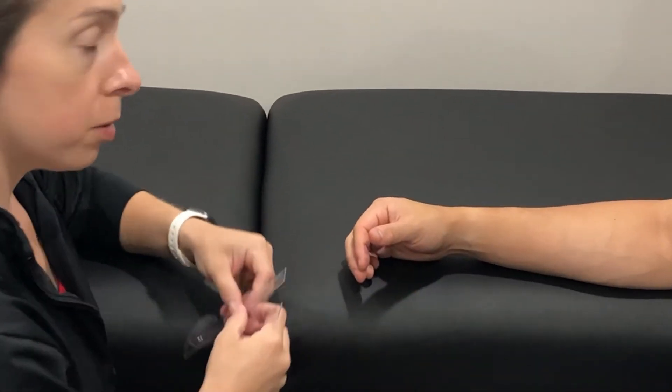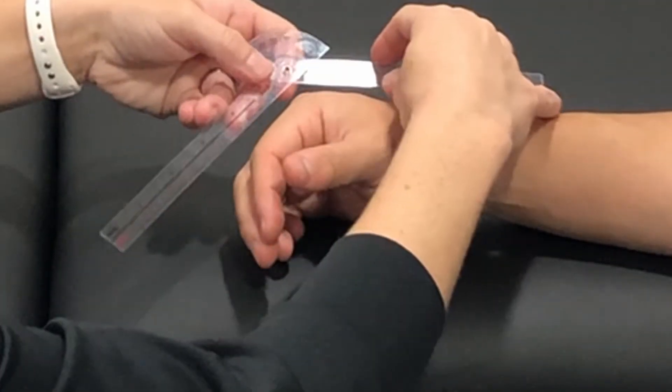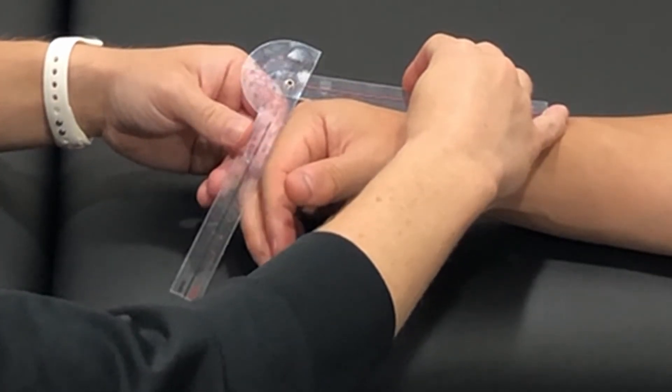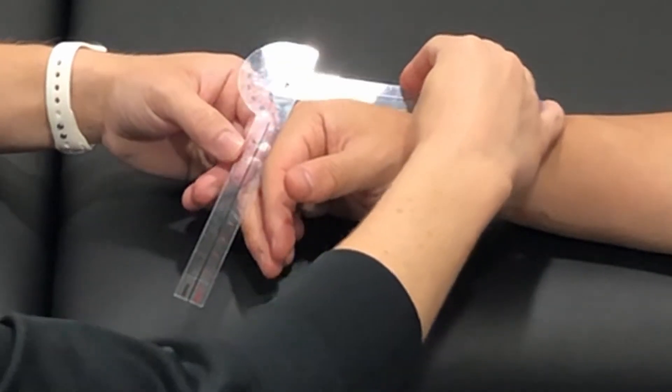Measuring active range of motion. I'm going to line my goniometer up such that the fulcrum is on the back of the MCP joint. My stationary arm is going to be along the midline of the dorsal metacarpal, and the moving arm will be along the midline of the dorsal proximal phalanx.